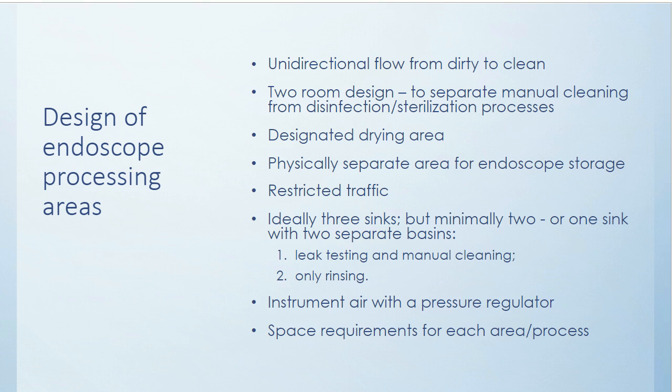The same applies to the design of the processing area. We know we have to do better with our facilities for endoscope processing. We can't let our clean and dirty areas be right next to each other. I see this happen all the time when I go in to audit facilities: their decontamination sink where they're brushing the endoscopes is right next to the AER. That's not okay.